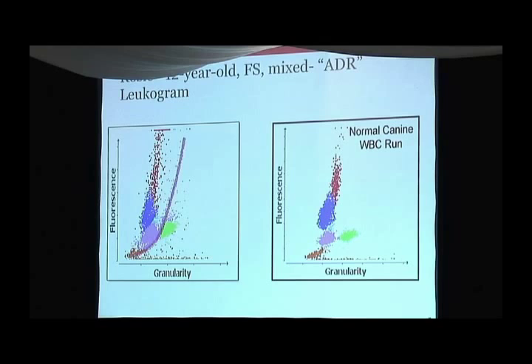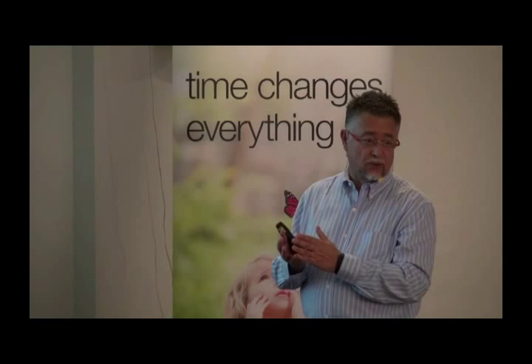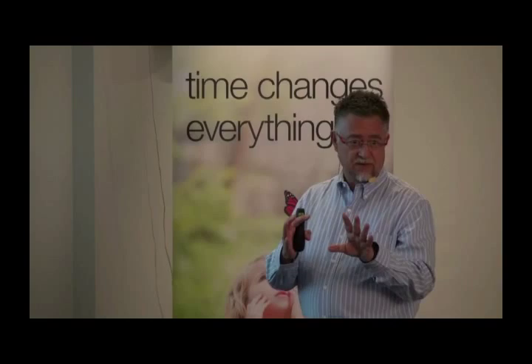So you notice that those EOs do not live where they should, okay? They are a little bit higher. All these are platelet clumps. What that means is that the platelets are aggregated and are being counted as white cells, so your differential will not be accurate, because it's going to tell you they have a lot of eosinophils, but they are not EOs, they are platelet clumps. Make sense? All right?